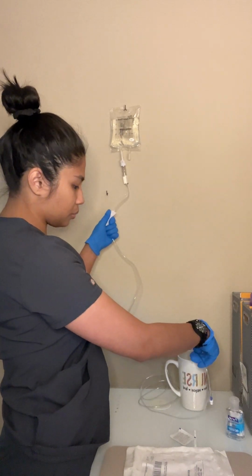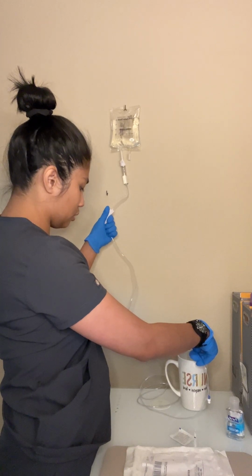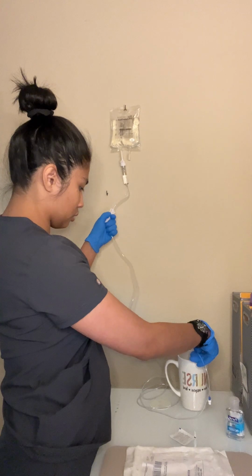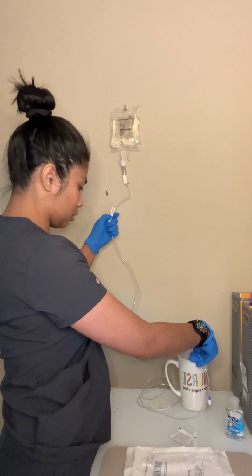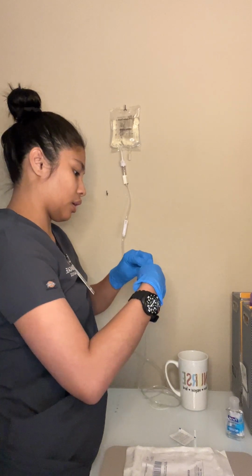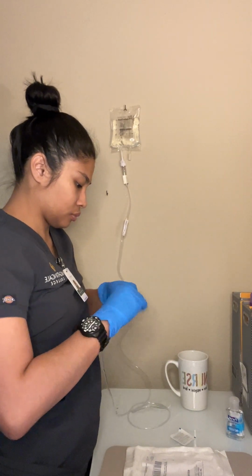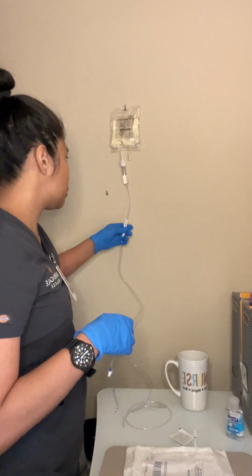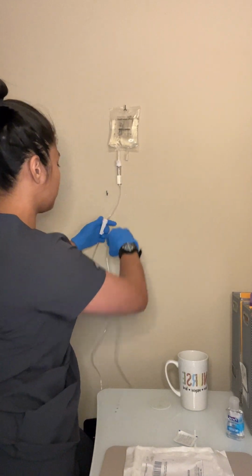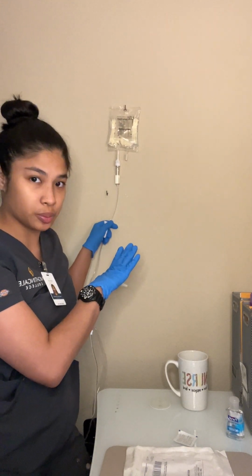Letting a couple drops of the fluid into the bin. Pause it. So to be able to regulate the drops, you'll see the drops coming in, and then you'll count them. The fluid is to run at 38 drops per minute.